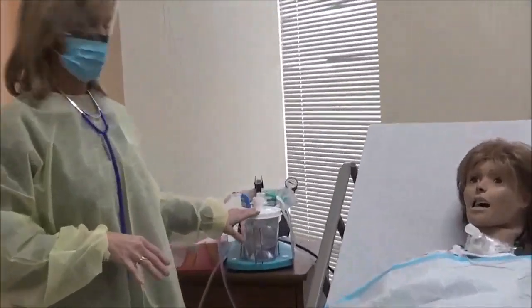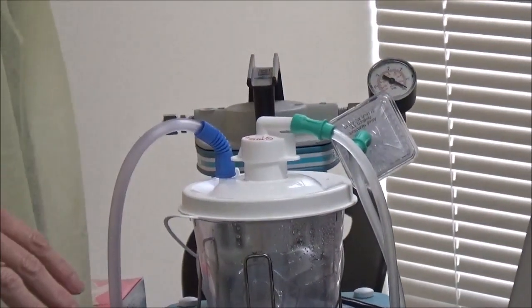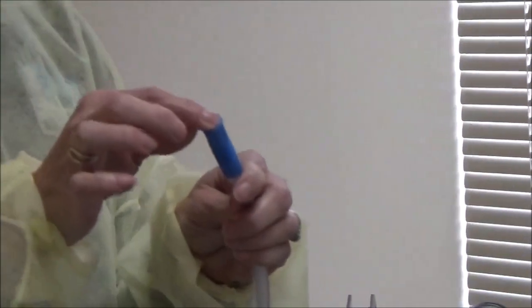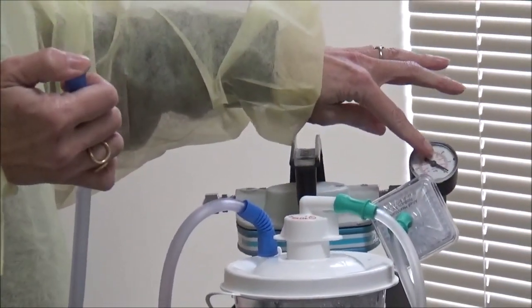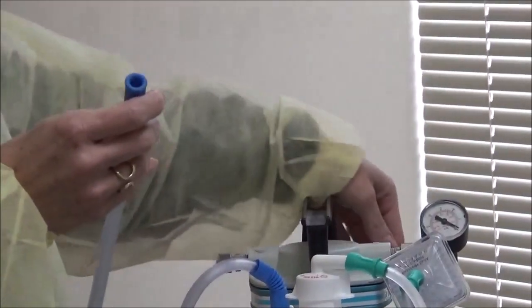I'm going to go ahead and check my suction equipment. Now, this is a portable suction, so for this, my suction settings on portable should be between 5 and 10. If it were a wall suction, then those settings are going to be between 120 to 150. But this is a portable suction, so in order to check the suction, I'm going to turn the machine on, and I have to occlude the end of the suction catheter to see what the maximum pressure is currently set at. I don't want to apply too much suction because that can cause trauma to my client. So I can occlude the end or I can pinch it off. So I'm going to turn the machine on.